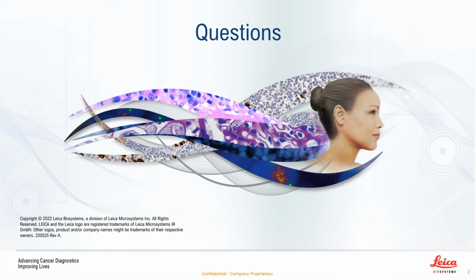And as I mentioned, I think in the presentation, moving from microscope review to on-screen review is a complete paradigm shift. So the more barriers or irregularities that we can remove and the more we can move towards standardization, it makes that much easier from a manual perspective. As I said, it's a two-part one though, because the other point where this really comes into play is as you start looking at the development of automated analysis tools or AI-based tools.